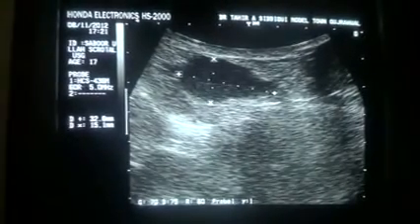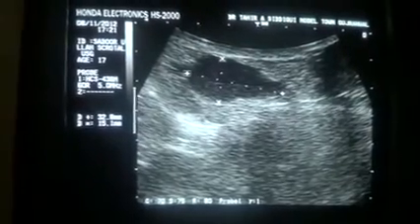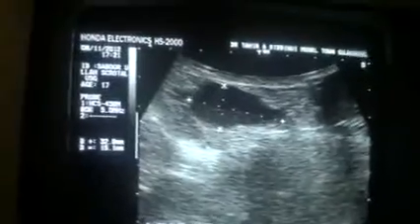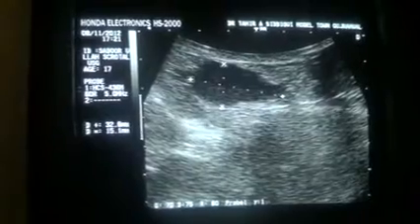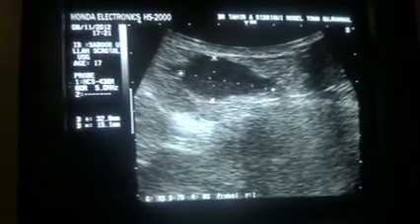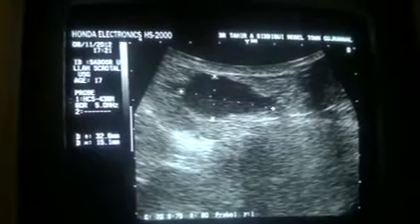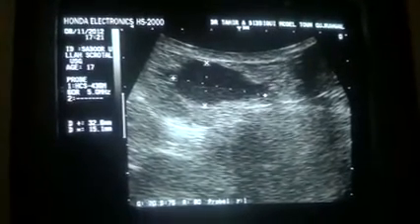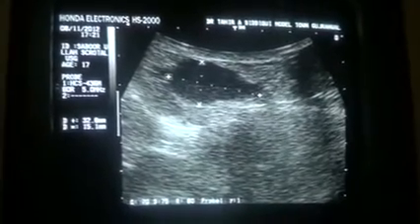So in this case, I will at least be of the opinion that this is a case of atrophic, small-sized right testis with no epididymis seen, and with a markedly decreased echogenicity, and the texture is not as we saw in the left.